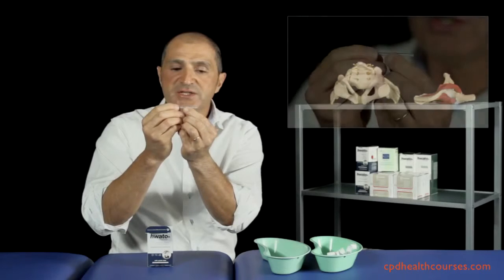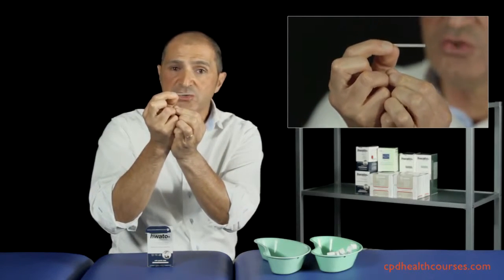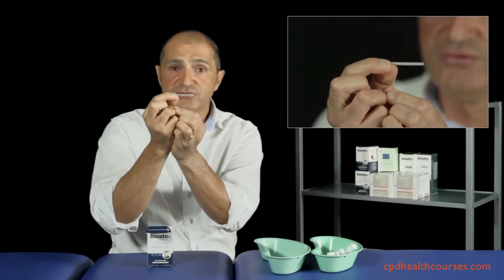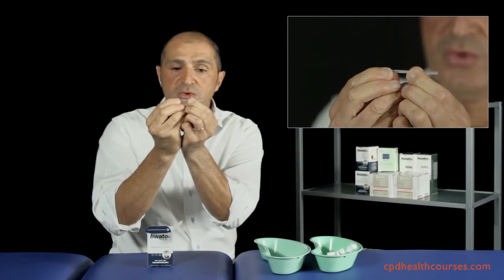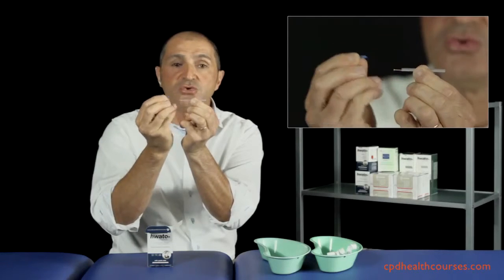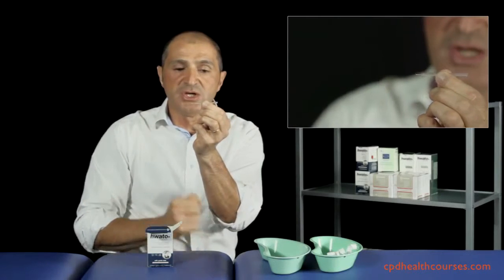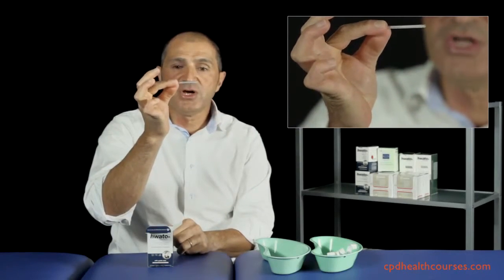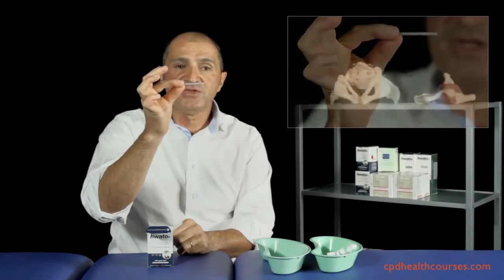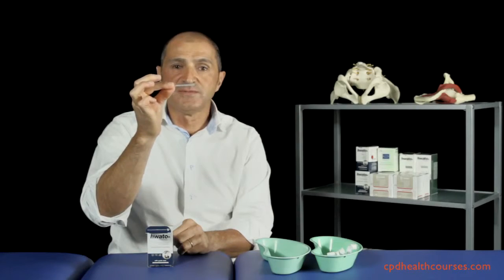What's required is that you must make sure that the needle in the guide tube is parallel to the ground so you don't drop the needle once the tab is removed, and you use a pincer grip with your non-operating hand here to remove the tab. Get rid of that, pop that into the waste kidney dish and place a pincer grip again so that you've got the guide tube and the handle of the needle pressed between your thumb and index finger ready to use. So that's the demonstration for the first method.